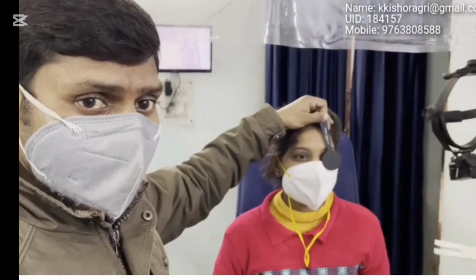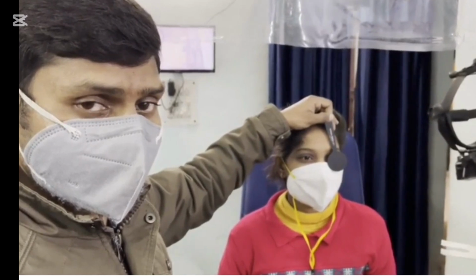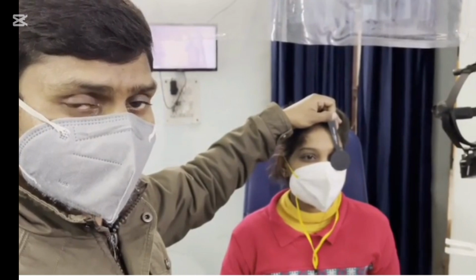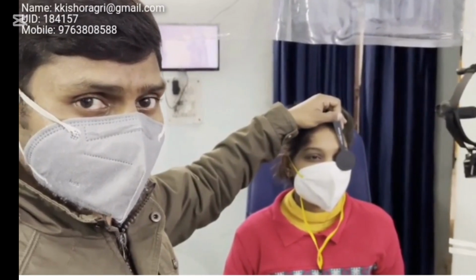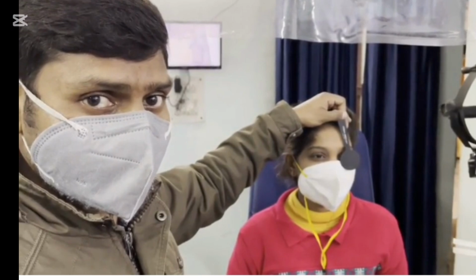Now coming to the procedure. For testing visual acuity, the patient is seated at a distance of 6 meters from Snellen's chart so that the rays of light are practically parallel and the patient exerts minimal accommodation. The chart should be properly illuminated, not less than 20 foot candles.